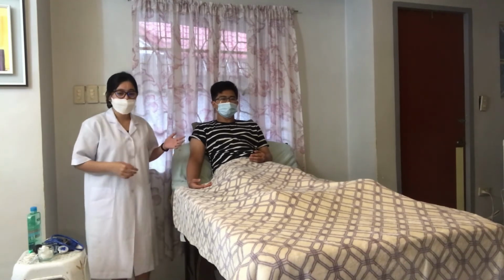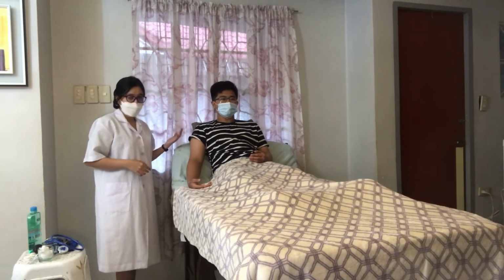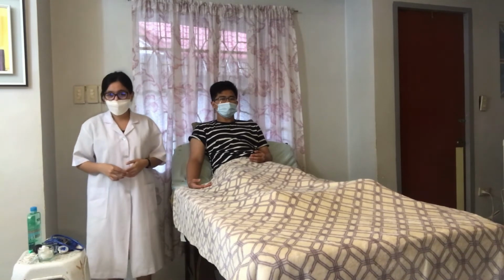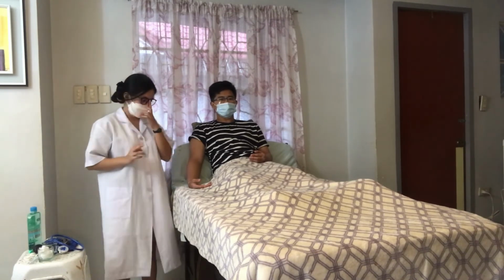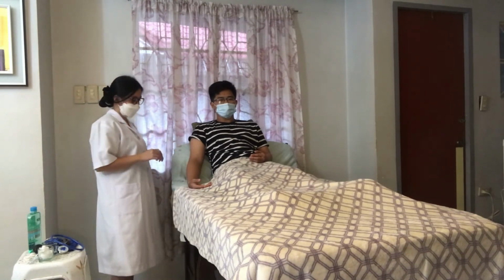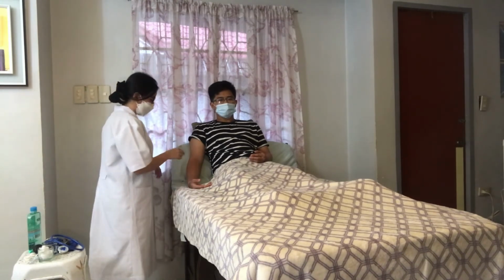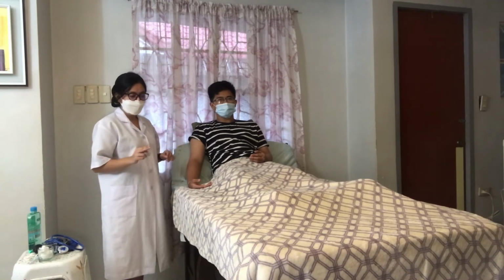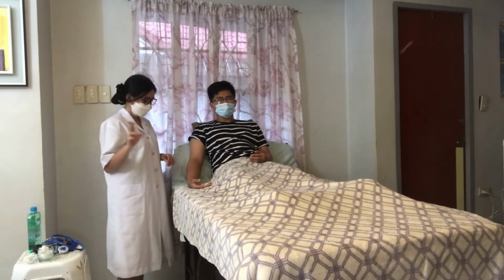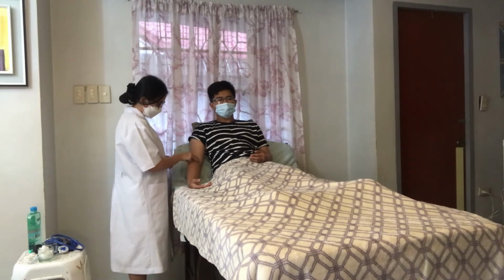Now after we have folded the shirt sleeves of the patient, we are then going to identify the brachial pulse, for this is where we are going to place our sphygmomanometer. So in identifying the brachial pulse of the patient, we must place 2 fingers and palpate for it.